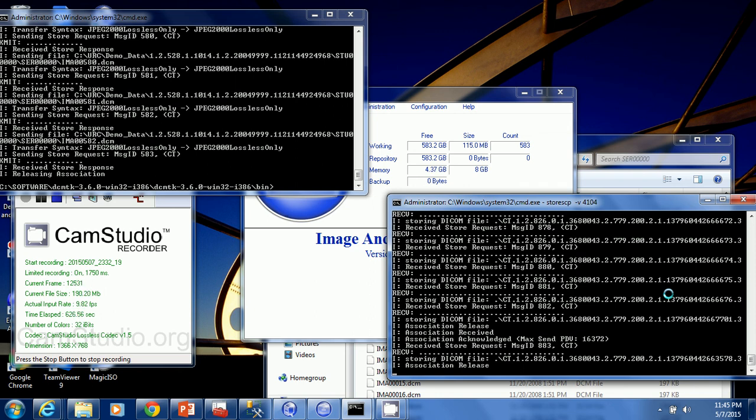So we could receive it as uncompressed, and we can be compressing it as we send it, or the other way around. It can be received compressed, and then we can uncompress it on the outbound side, all depending on what the different systems support.